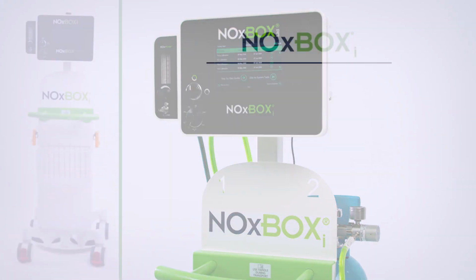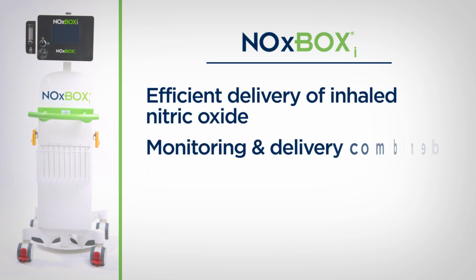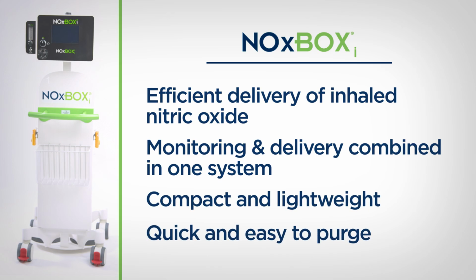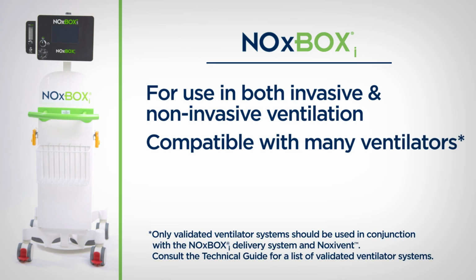The NOxBOXi system delivers inhaled nitric oxide therapy efficiently. It combines the monitoring and delivery of the inhaled gas in one system. It's compact and lightweight. Purging the system is quick and easy. It may be used with both invasive and non-invasive ventilation and is compatible with many ventilator systems. Consult the technical guide for a list of validated ventilator systems.